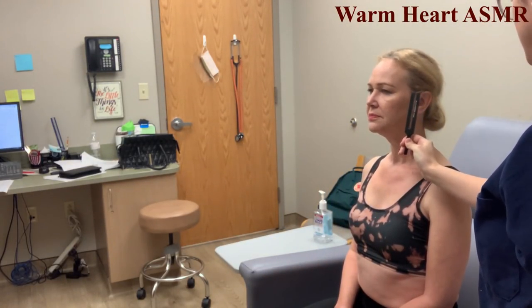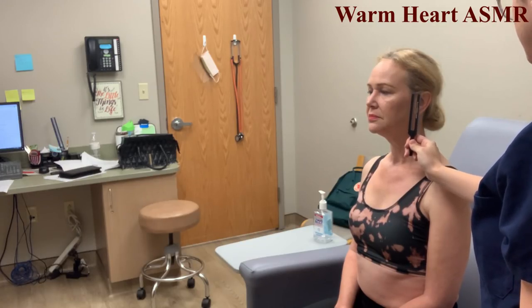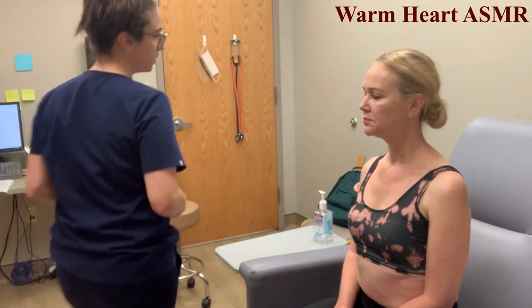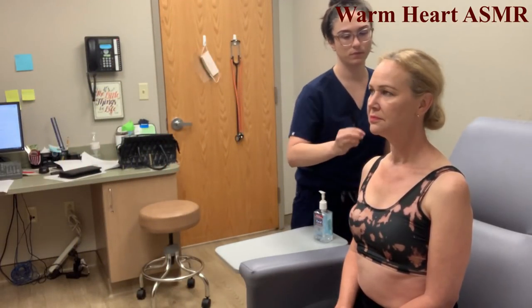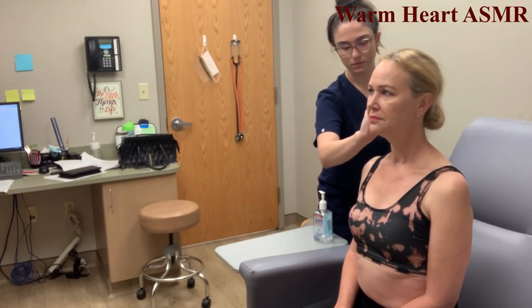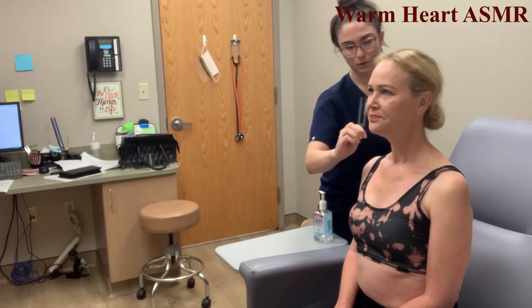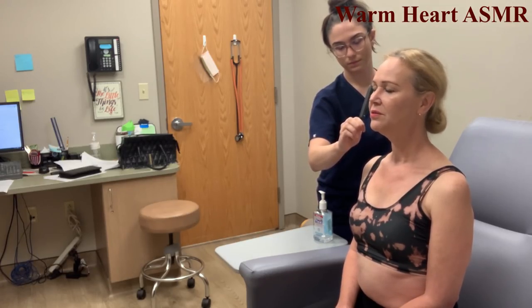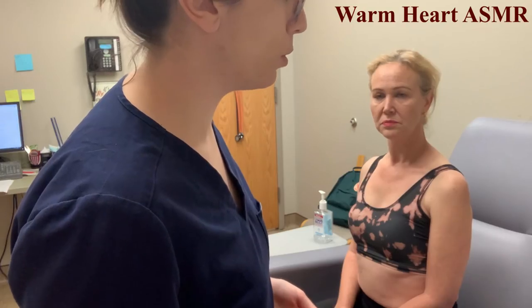Performing the Rinne test on both sides. Air conduction was twice as long as bone conduction — that is a normal finding.